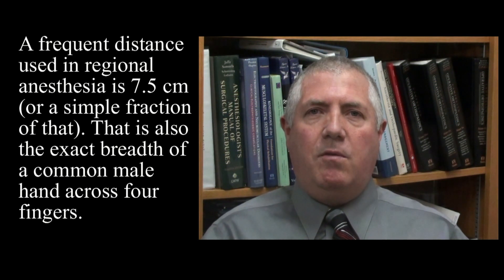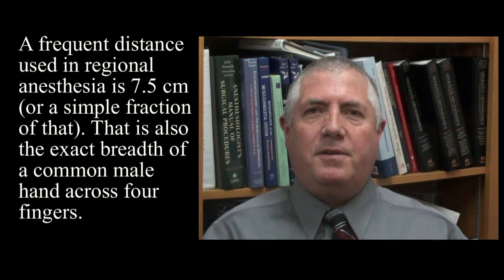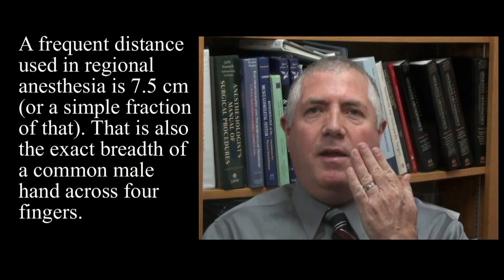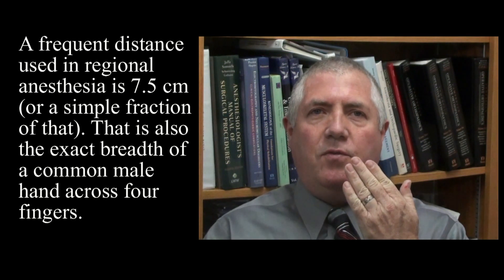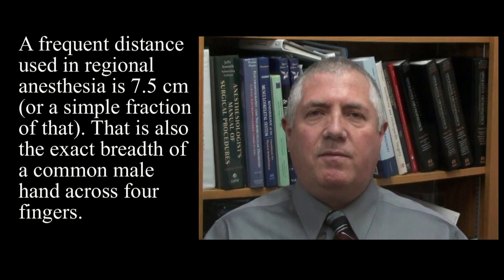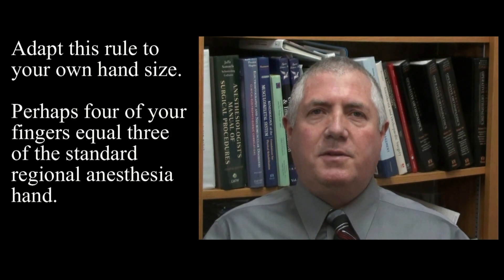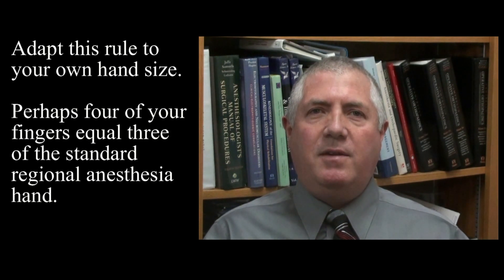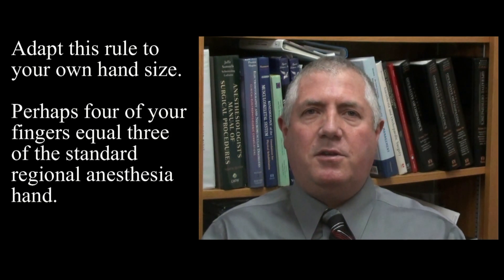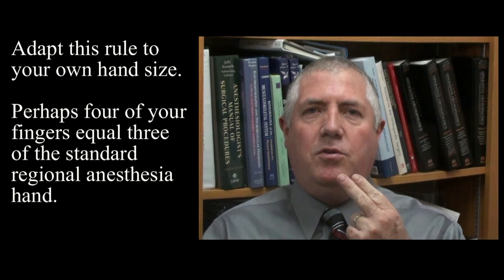A regional anesthesia standard hand size is 7.5 centimeters across four fingers. Some blocks use a portion of that distance, such as three fingers or two fingers spread.